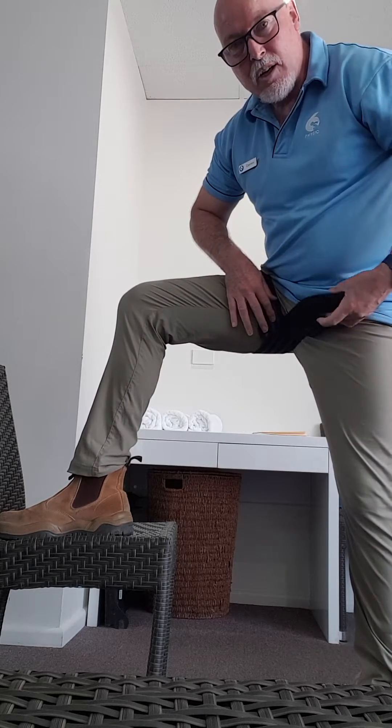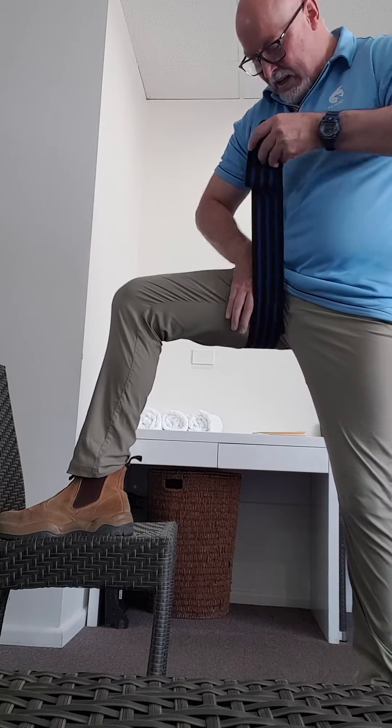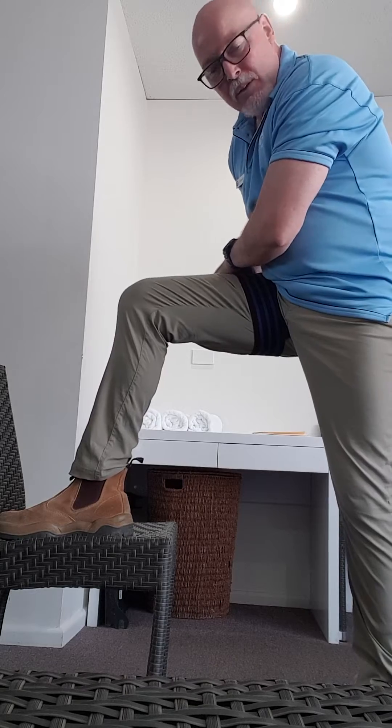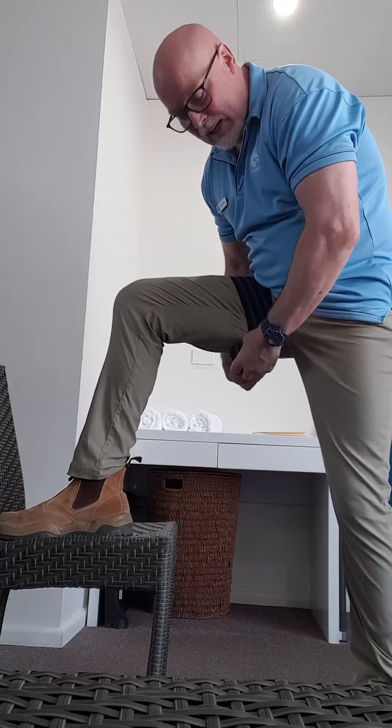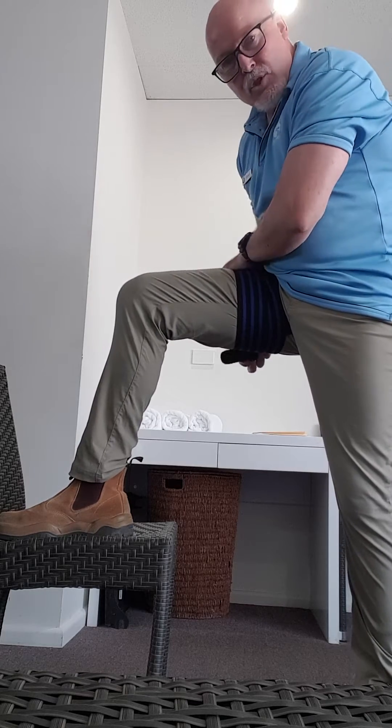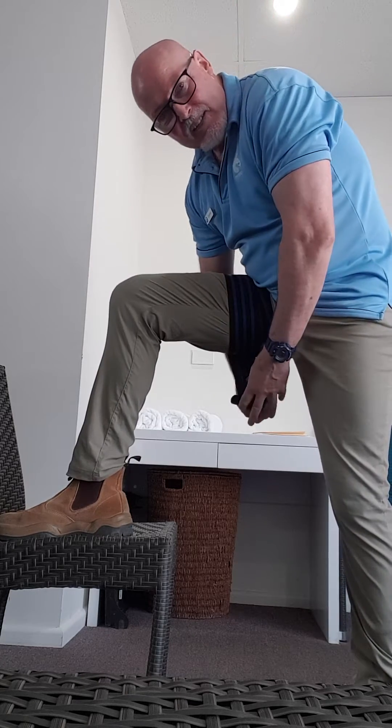When you get to this side, you're going to pull up quite firmly and wrap it across that loose end. Then you can overlap a little bit as you work your way around the leg. You've got to keep this pressure quite firm because what we're trying to duplicate is the pressure that we've assessed in the clinic.